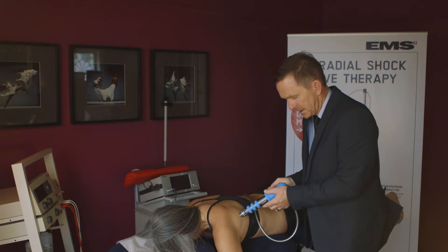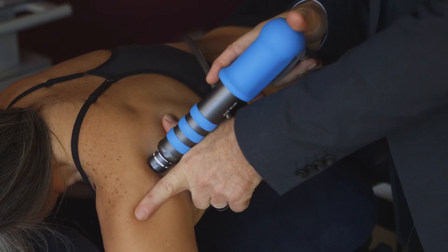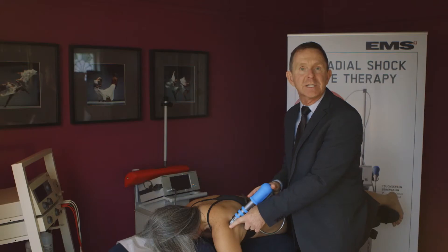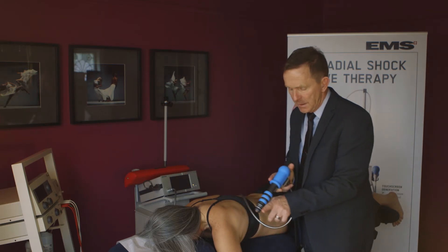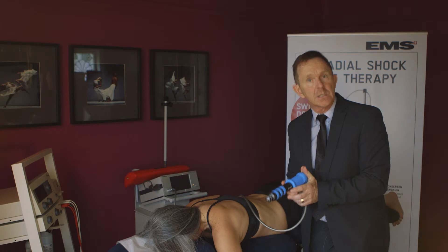Some people like to hold it like so. I personally like to reinforce. It's the smaller areas that we have a problem with and we slip sometimes, particularly on the Achilles tendon. So some reinforcement like so. Seated is also useful.